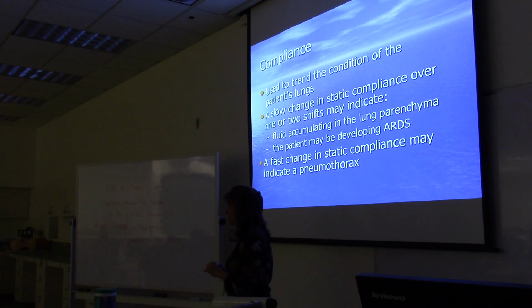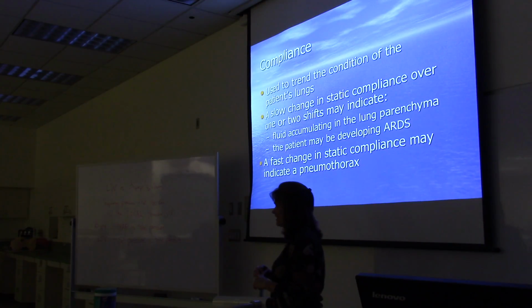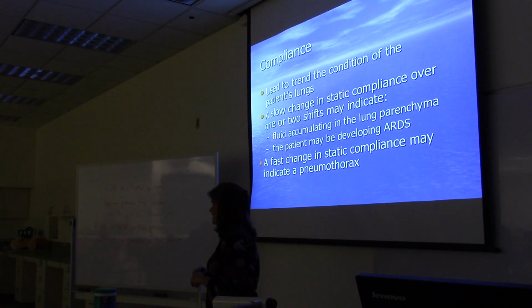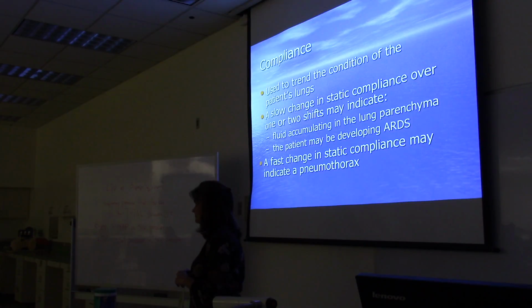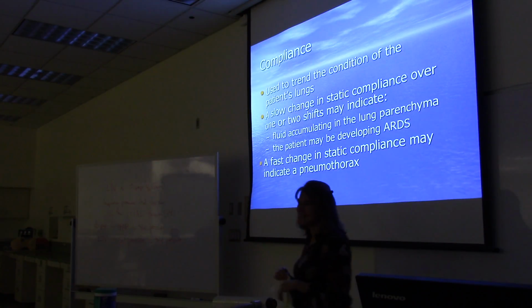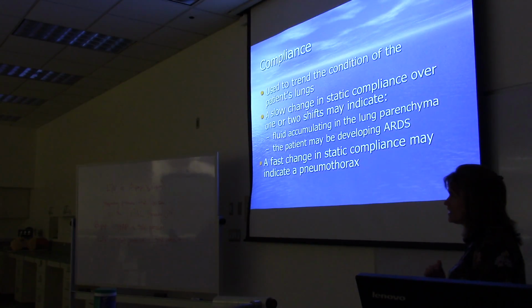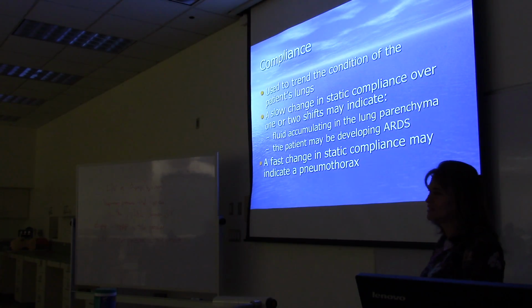You want to write that? Yeah? So that was the answer on the test question, was the answer increase airway resistance then? Because if the plateau pressure stays the same, then it would be airway resistance. Okay. Did you get that right? I did. All right, so ARDS means stiff lungs, which means higher plateau pressure.